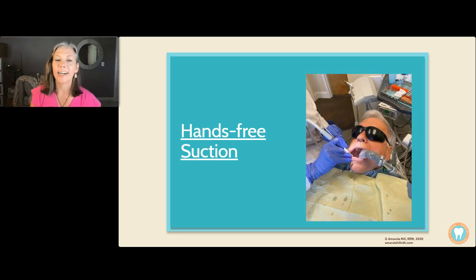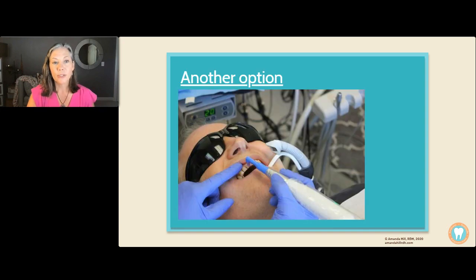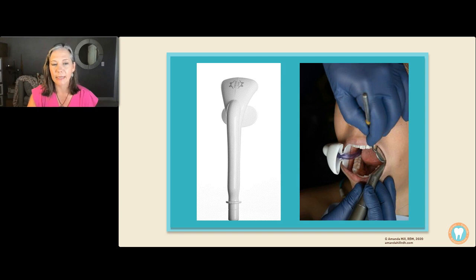This is actually my dad for his perio maintenance visit, and I use Isovac a lot, especially with my air polisher. I really like it. It really controls the aerosols well, shown by that Kamisi study. Another option, they have some other great devices that help capture some aerosols this way, so you can use your saliva ejector, but it hooks up to your HVE and it can capture some aerosols that way. This is another one by Aerosol Assist. And this is neat because you can autoclave that white device, and the studies show that it captures a pretty good amount of the aerosols. So that's another option as well.